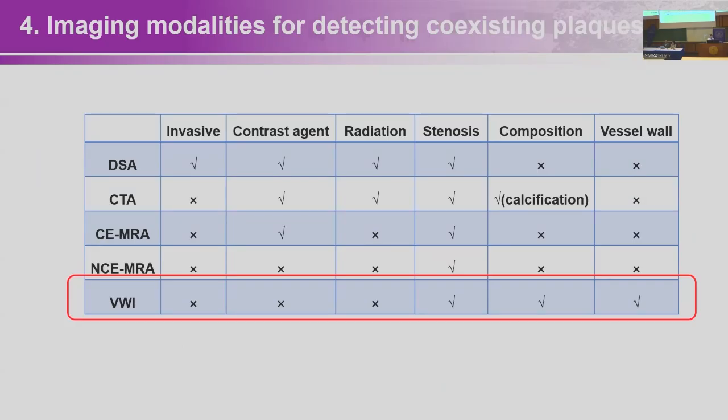Apparently, vessel wall imaging can be an ideal approach to image both the intracranial and extracranial carotid artery vessel wall simultaneously.